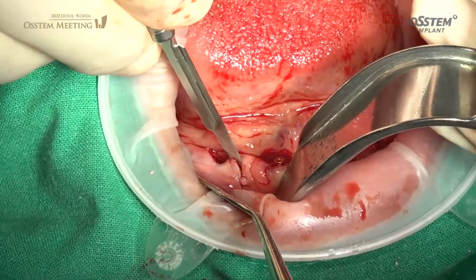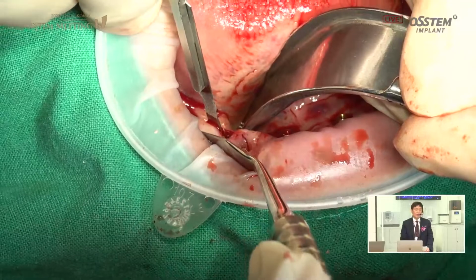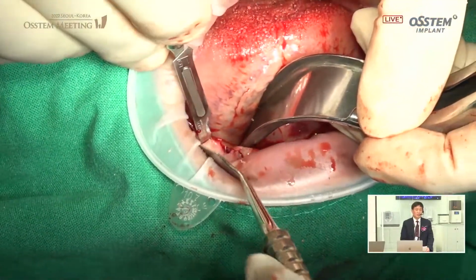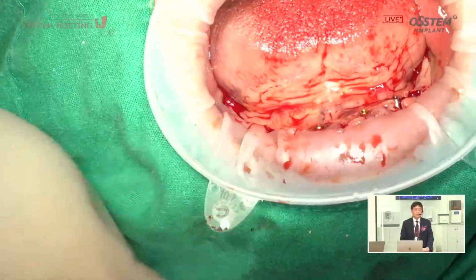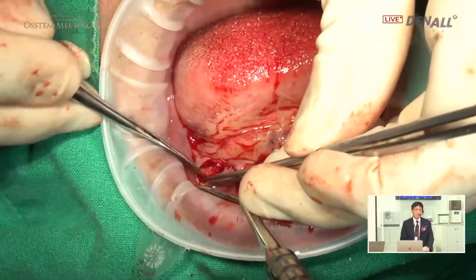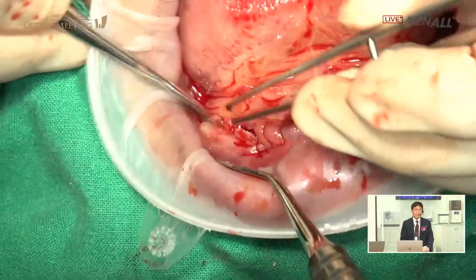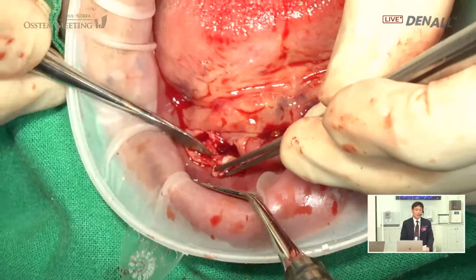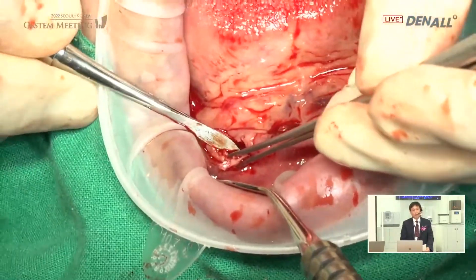In number 30, the abutment is connected, and in number 40, a mini flap is formed to expose it slightly.